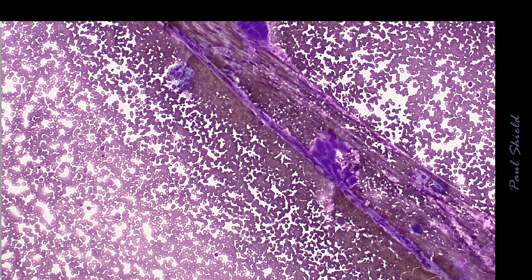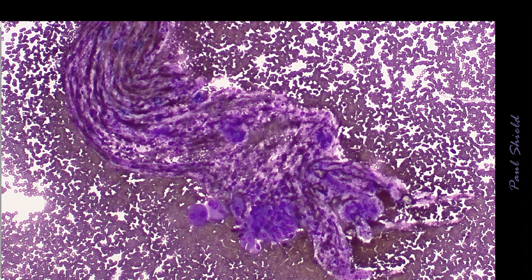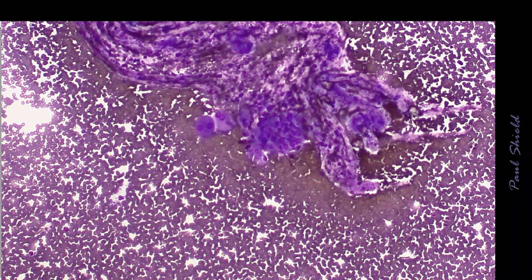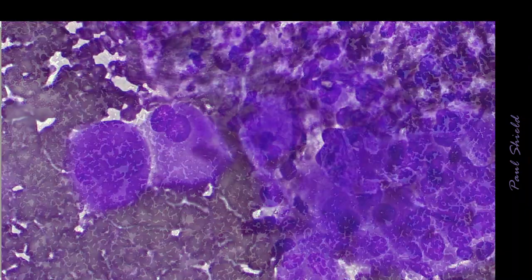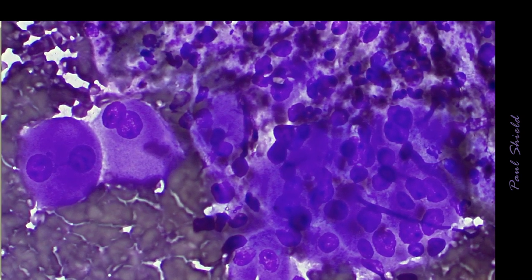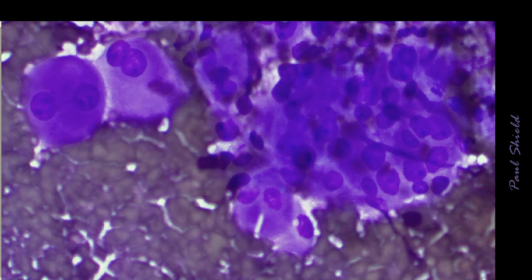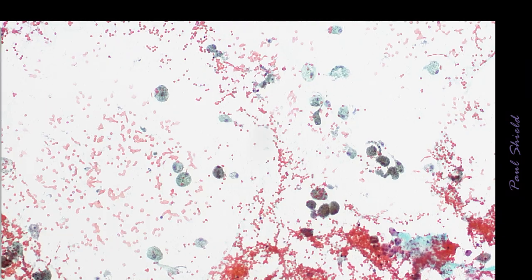This is quite bloody and poorly spread. You can see lots of clots, and in amongst the clot are largish looking epithelial cells even on this power, and on high power you can see they have abundant cytoplasm and quite large but round, uniformly round nuclei with what looks like little nucleoli in them. The PAP is probably better preserved and stained, and it shows a lot of hemosiderophages.